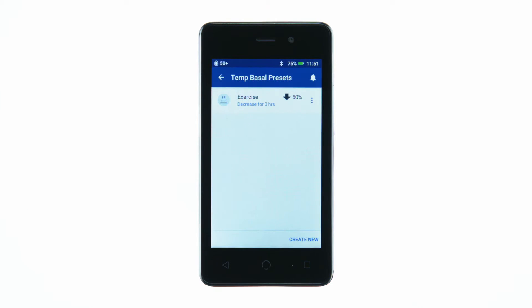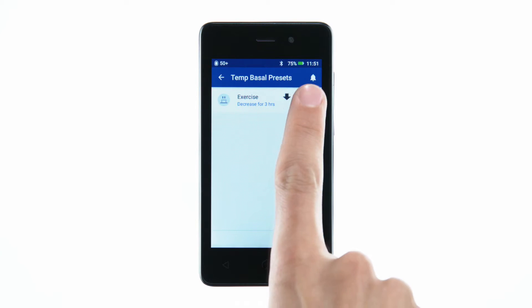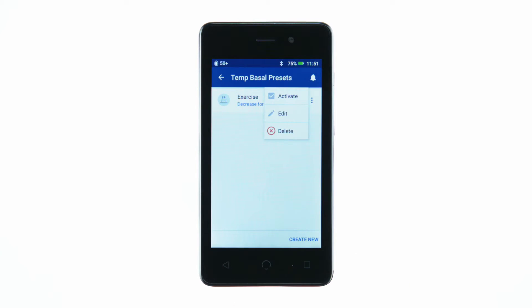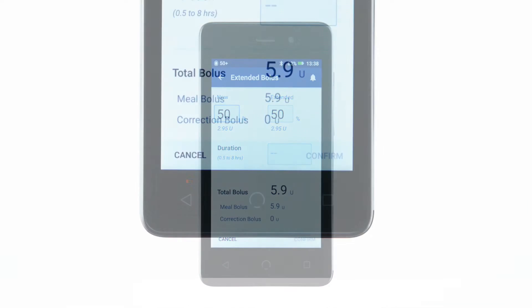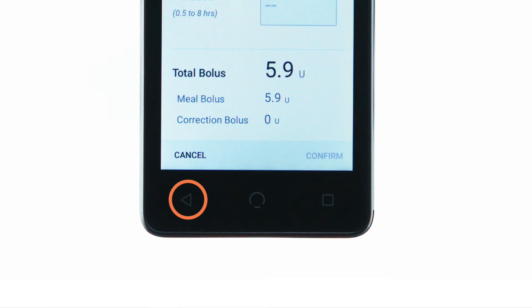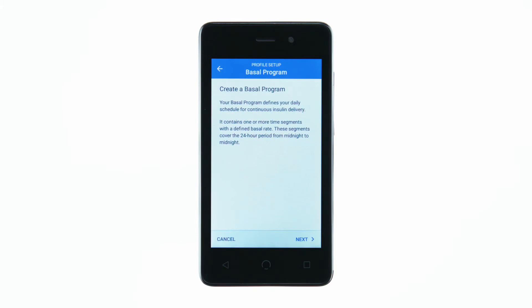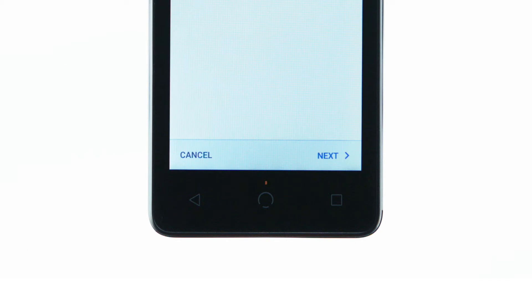Options icons appear on the right side of certain lists. Tapping the options icon brings up a list of options relevant to the item in that row. Both the on-screen back buttons as well as the triangle button beneath the PDM screen can be used to navigate to the previous screen. The circle and square buttons beneath the screen have no function.